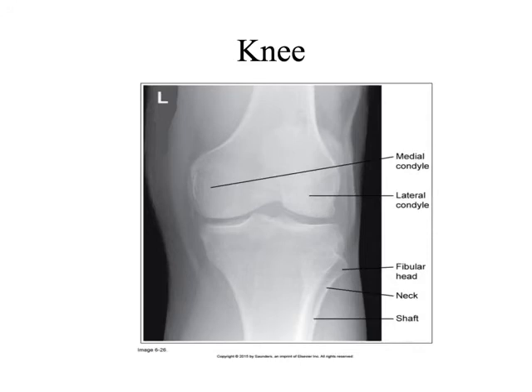And then maybe even prop up their foot. Has anybody been doing that? Propping up the foot with a wedge sponge? Another thing they were telling me at Campbell's is that if you make sure the foot is propped up a little bit, you're most likely to get a good lateral in general. Yeah, no, it is a little bit patient dependent.